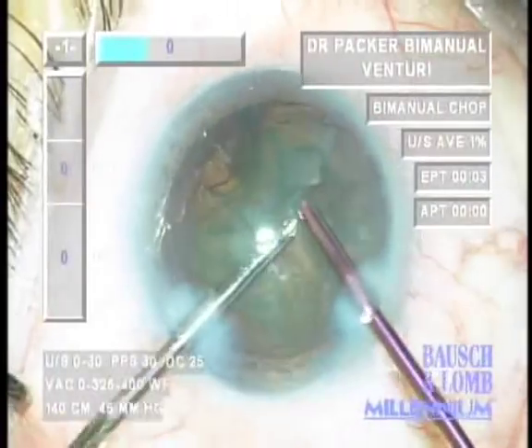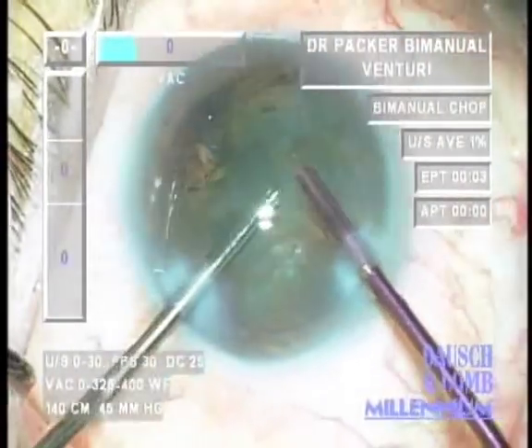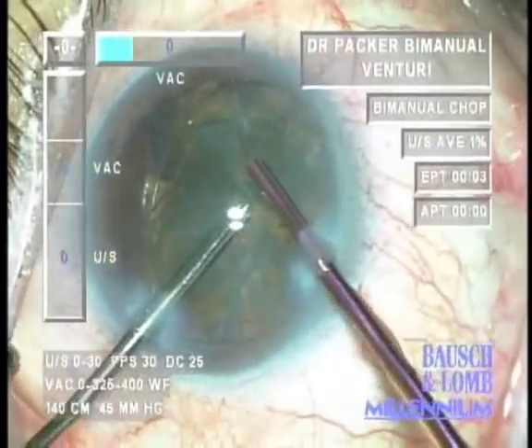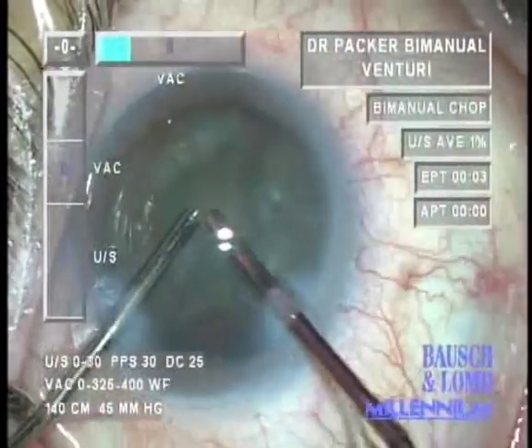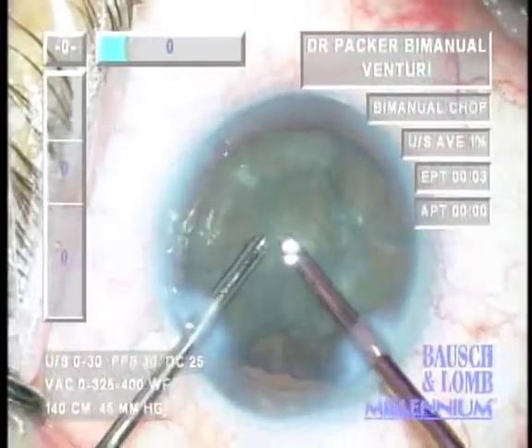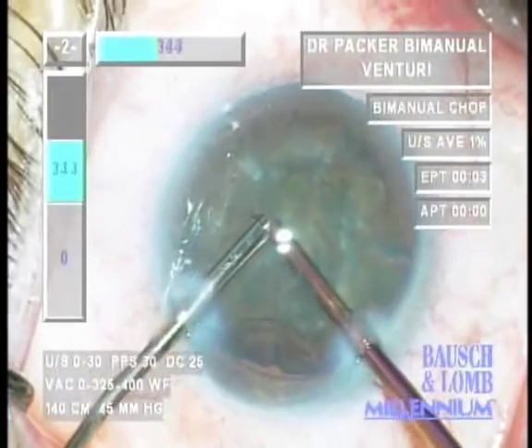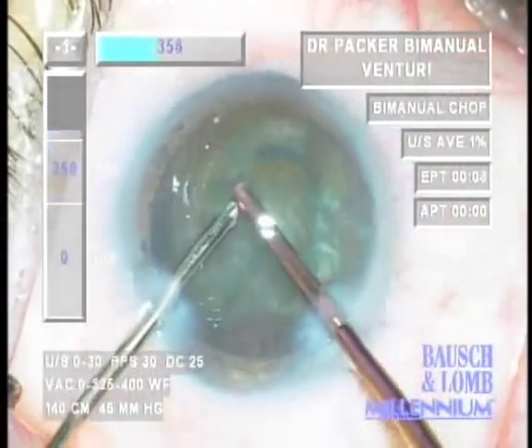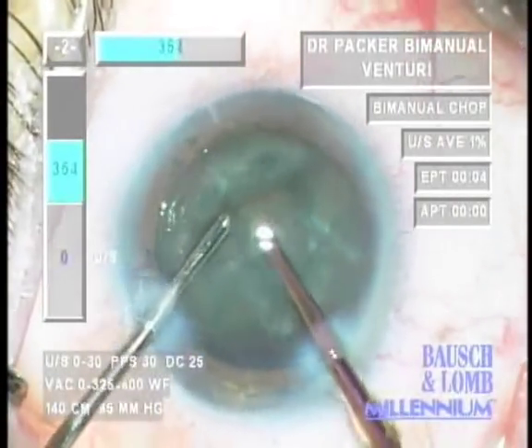With older machines, larger amounts of compliance in the system meant surge was a problem. However, using this 700-micron system, surge is reduced because there is a limitation to aspiration flow by virtue of the smaller inner diameter of the tip. This means the ability to use higher vacuum and aspirate material effectively without loss of chamber stability.